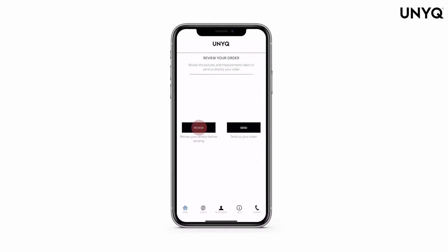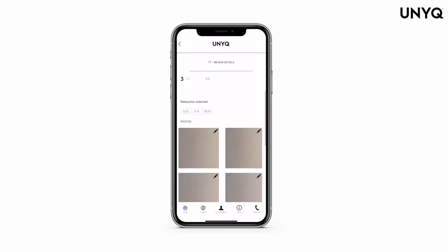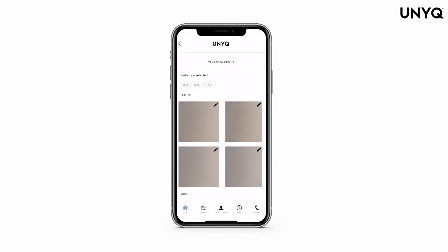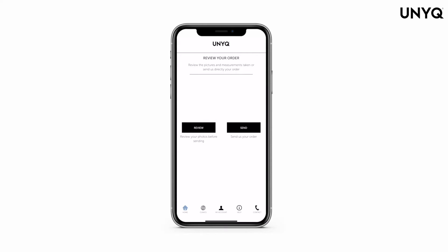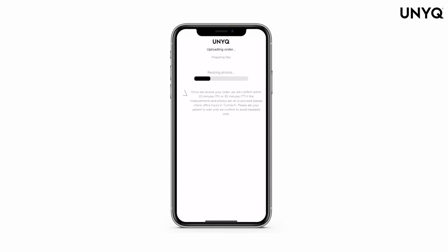You can review your order before sending it. There is a pencil in the top right-hand corner of each image so you can retake that image if necessary. Then press next. Please press send. Your order will be reviewed and accepted if all details are correct.